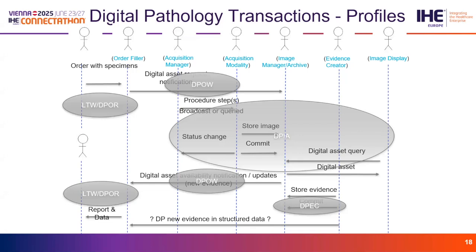Now, with the ability to actually transfer metadata, it's possible for the acquisition manager, the software that runs the scanner, to receive information and package it into the DICOM file as the image is being created.